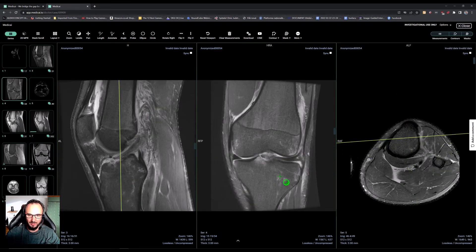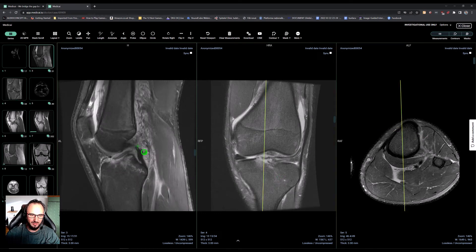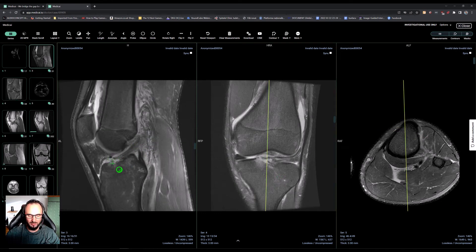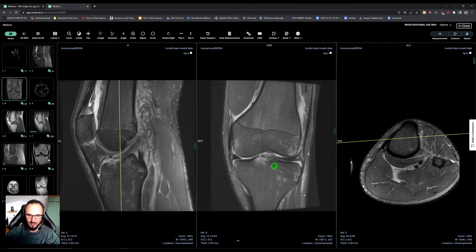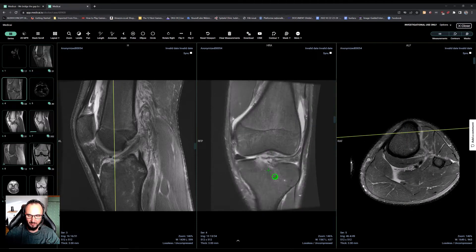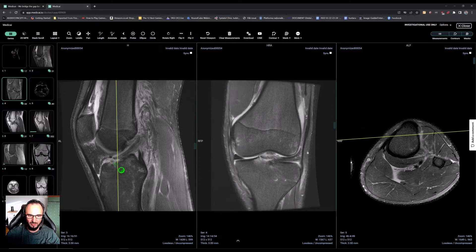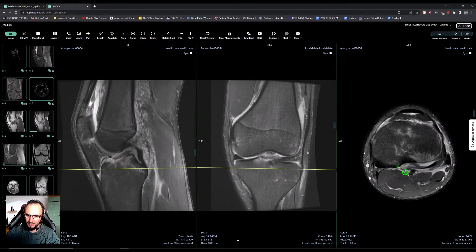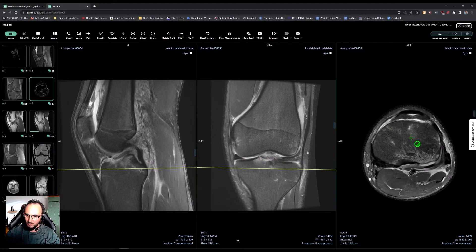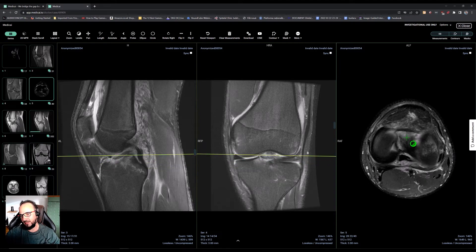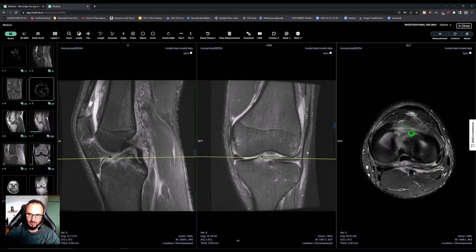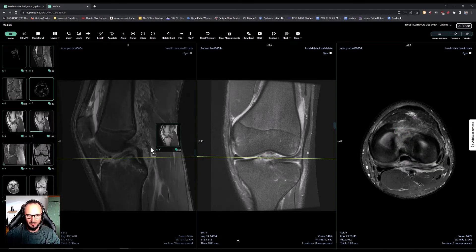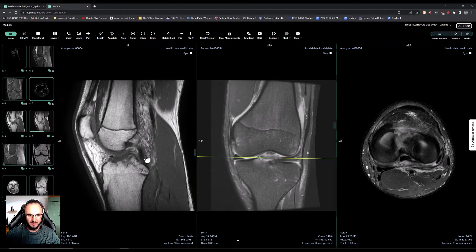We can see that there is an avulsion of a small bony fragment of the tibial plateau, which is still attached to the ACL. You see the fracture line here, and you see inflammation around the fracture site. You can very well appreciate this fracture also on axial — or maybe not so well on axial. Nevertheless, let's try T1.